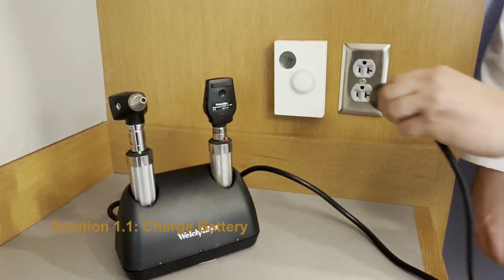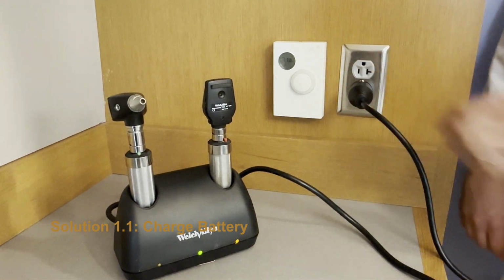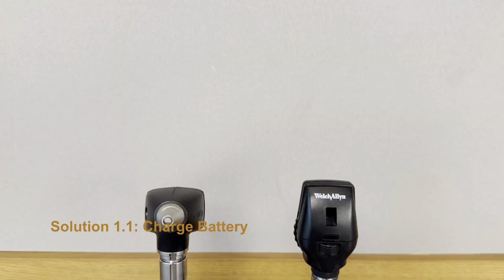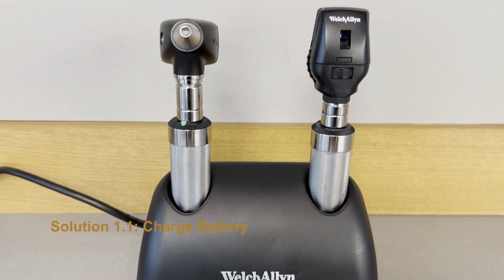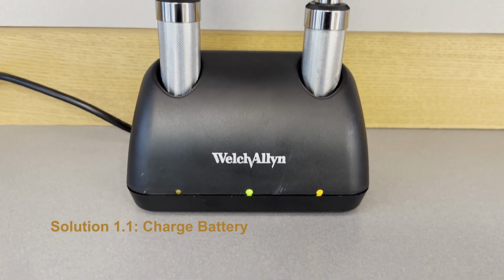Note: some otoscopes and ophthalmoscopes come as a set with a double charging port. In some models, if one of the scopes is docked incorrectly, the other scope will not charge. Check that both scopes are docked correctly.